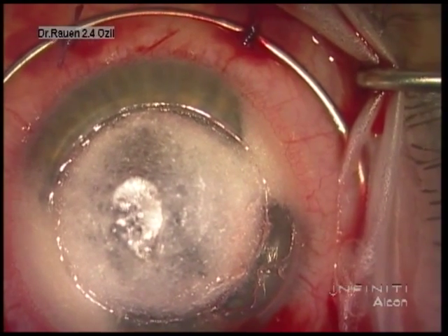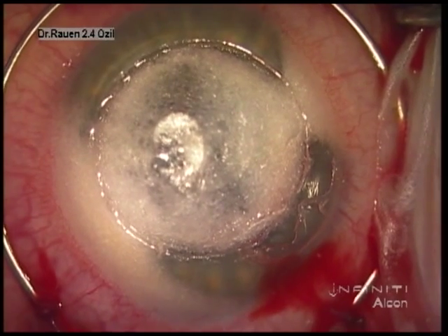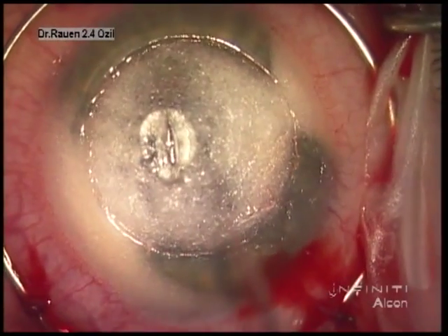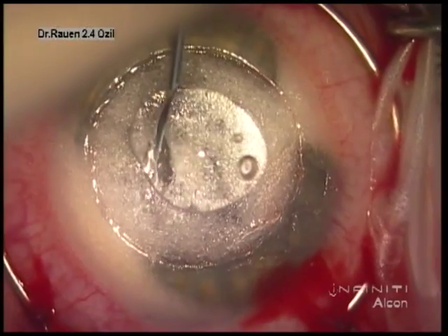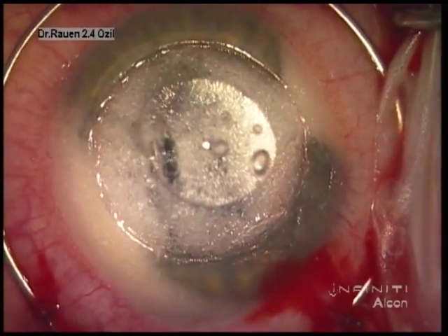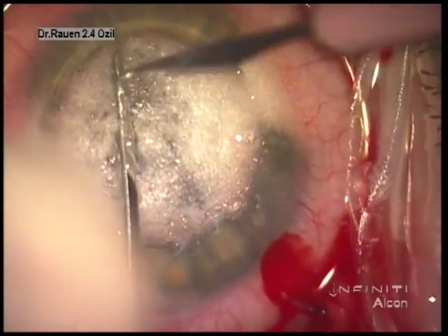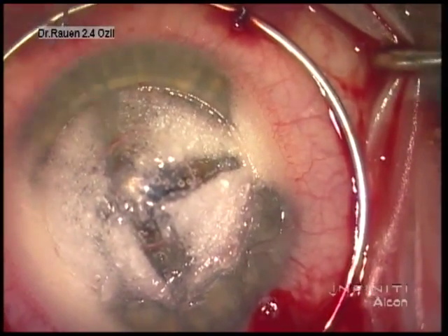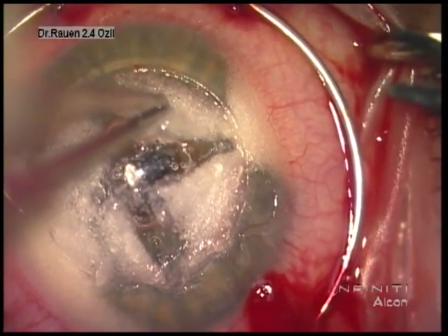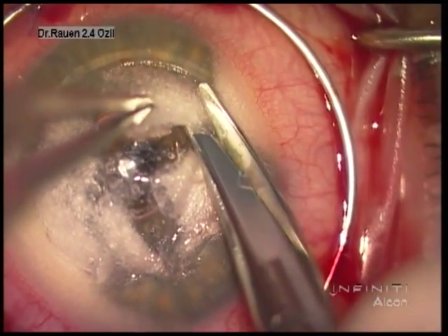We place a small amount of viscoelastic on the surface of the remaining stroma and we'll use a super sharp blade to enter the cavity. Notice the air bubble seems to vanish, but we all know that it has now moved to the center of the eye. We perform some additional dissection with viscoelastic and then use the triangular spatula to help us create the initial openings within the cavity.